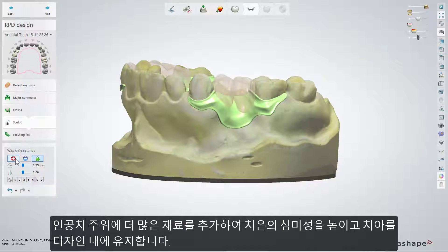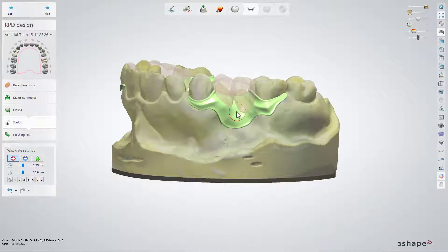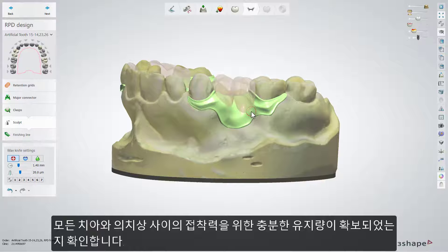Add more material around the artificial teeth to have nice looking gingiva and to keep the teeth within the design. Make sure that there will be enough retention, which makes a good bonding between all teeth and the denture base.